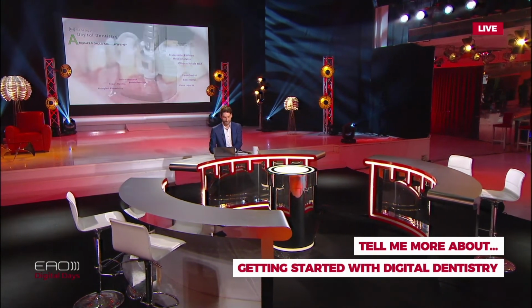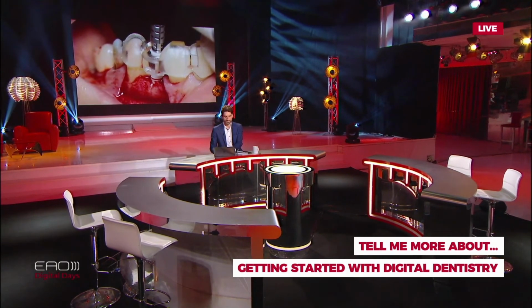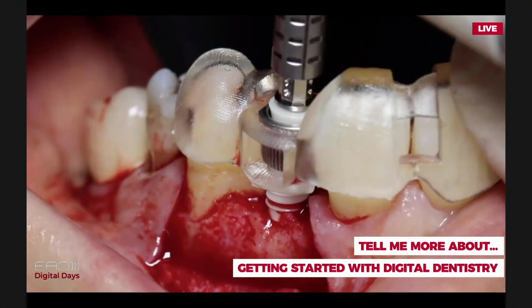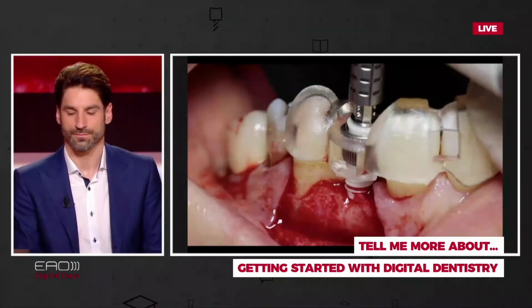But when we are talking about accuracy, you have to think one thing. One thing is to compare digital protocols, especially in implant dentistry and surgical guides, against your free hand.